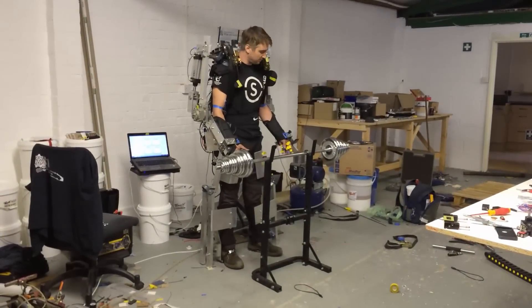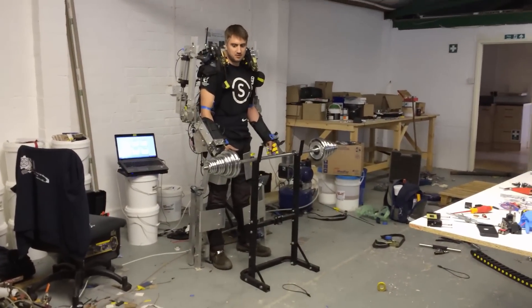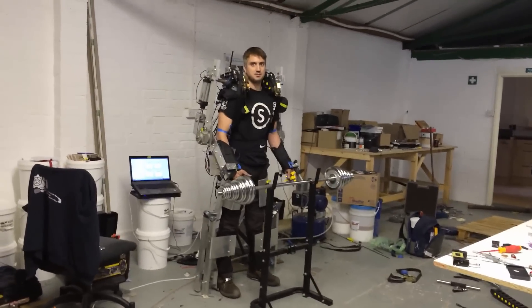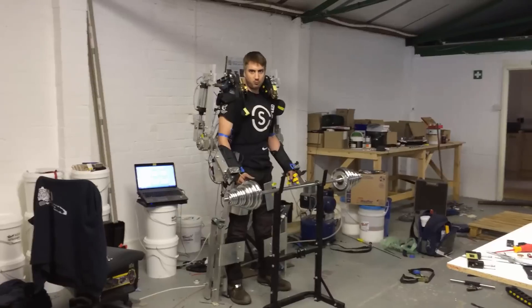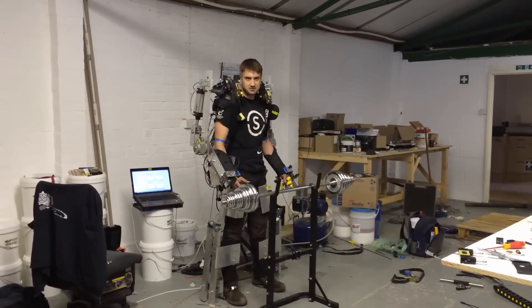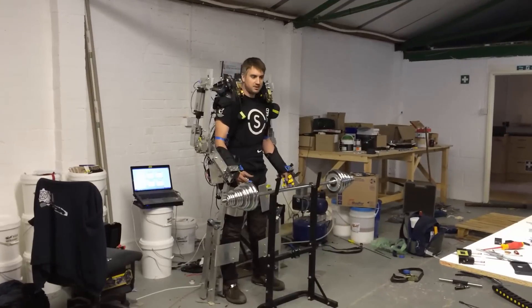This is the final prototype of the exoskeleton, which shows the degrees of freedom. You can walk around in it quite comfortably. The entire upper body weight is transferred straight through to the floor through these legs, and I've only actuated the arms so far.